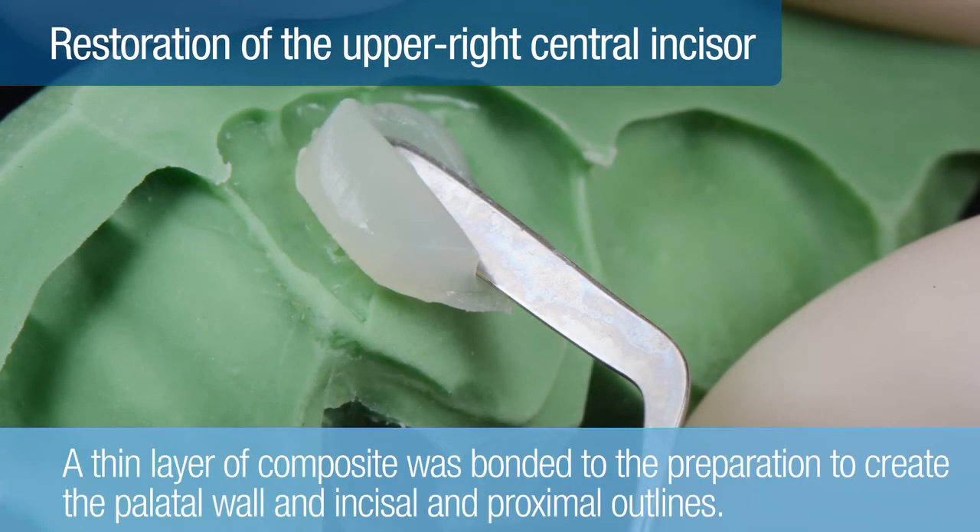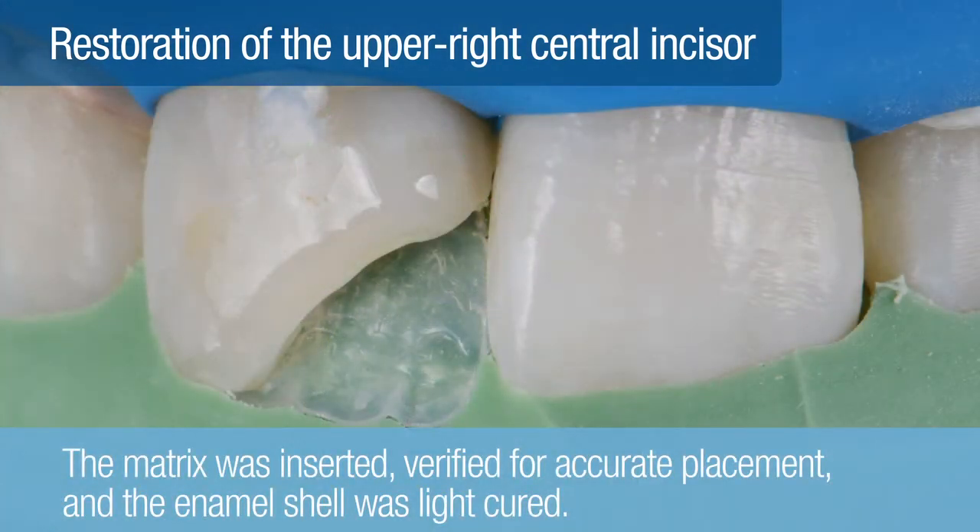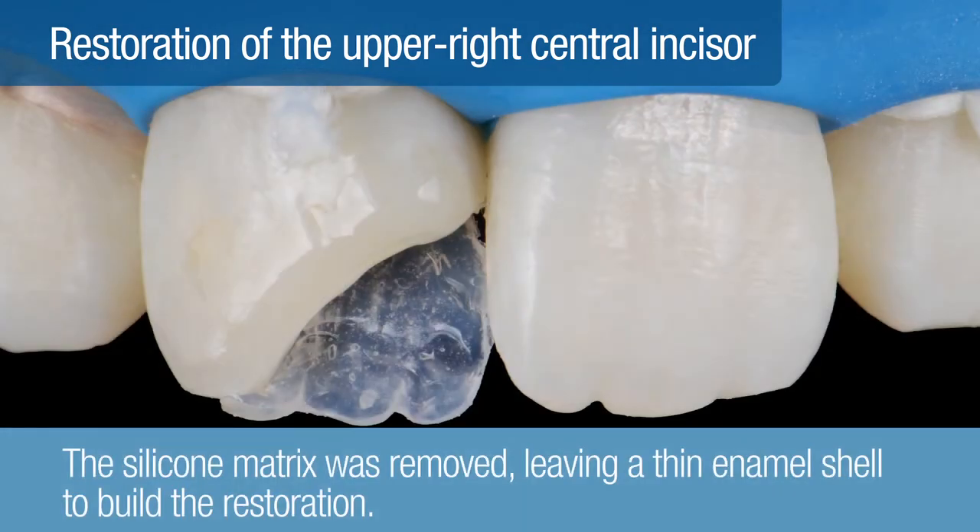Next, a thin layer of composite was bonded to the preparation to create the palatal wall and incisal and proximal outlines as captured by the silicone key. First, a thin layer of A3 enamel, no more than a few tenths of a millimeter, was adapted to the silicone matrix. The silicone matrix was then inserted, verified for accurate placement, and the enamel shell was light-cured. The silicone matrix was carefully removed, leaving a thin enamel shell on which to build the body of the restoration.